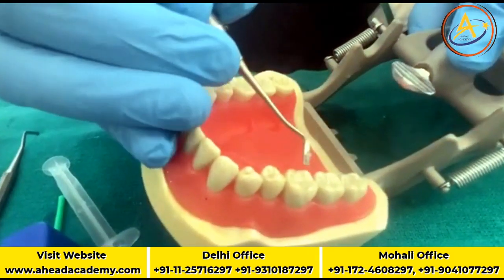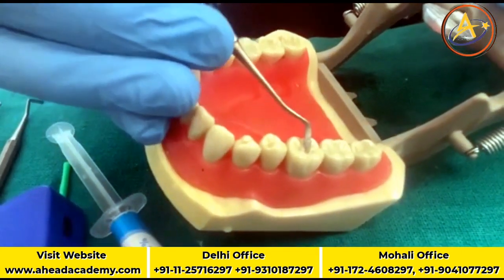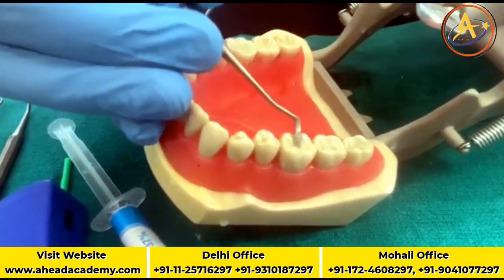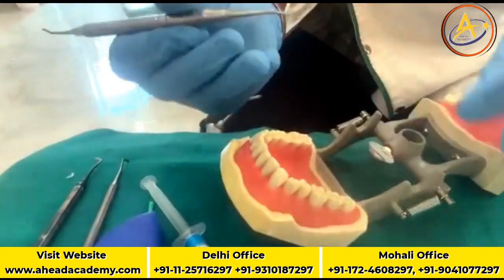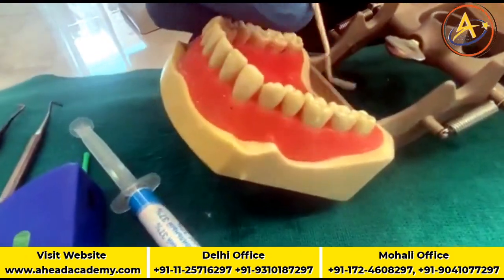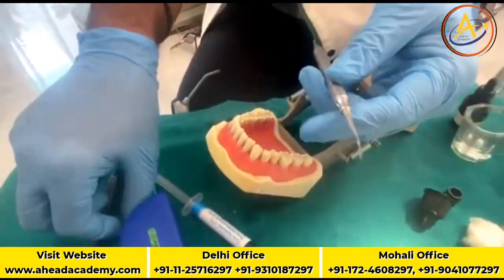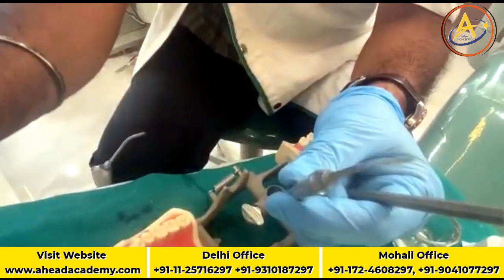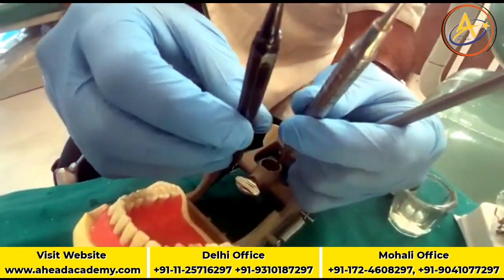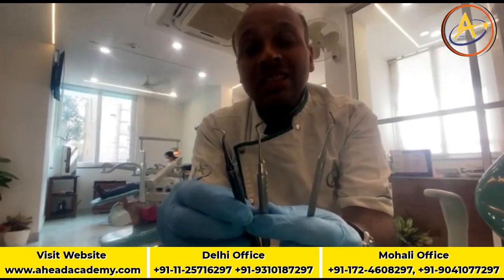Now many of the operators face a problem when they are doing this. What happens? Composite, just see, starts sticking and they start blaming the composite, saying it is very bad, my instrument is not good, I have purchased an instrument for 2000, still the composite is sticking. Now the most important thing is the cleanliness of the instrument. Right now I have the stainless steel instrument, this is a gold plated instrument, you can see the golden color, and I have a Teflon coated instrument. But remember, it's not the instrument which is responsible for the sticking of the composite. It's the clean surface of the instrument.